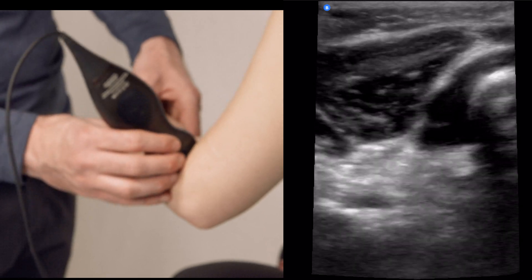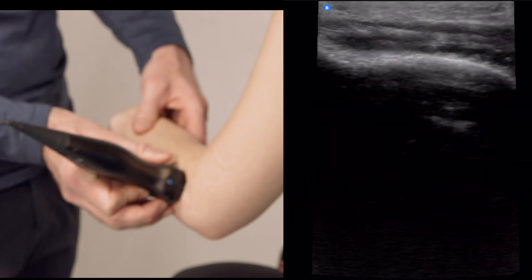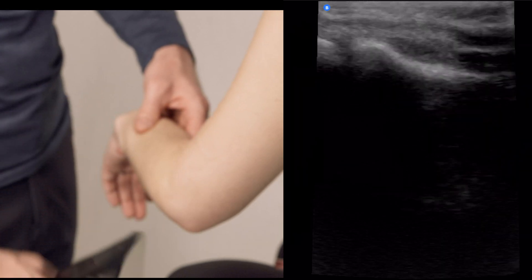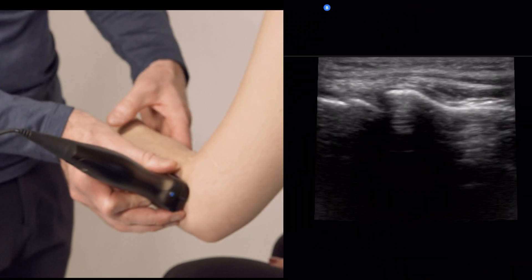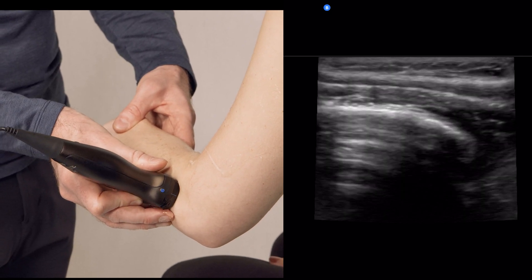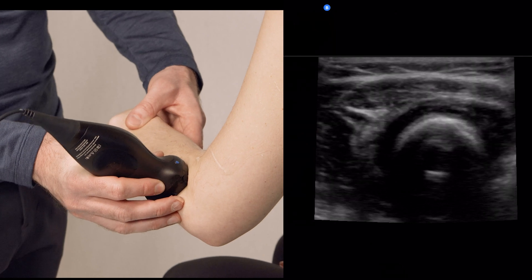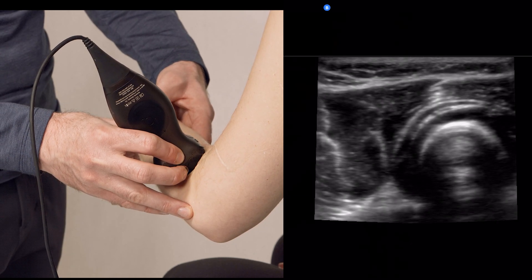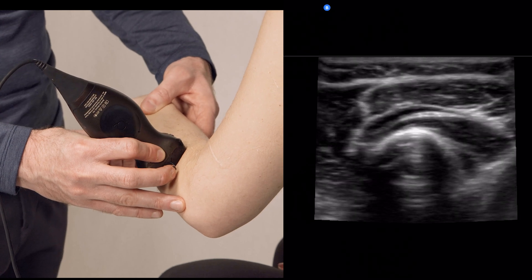What I want to draw your attention to first is the supinator, because the supinator is a very important landmark. The supinator is just above the radius here. Here's the supinator, here's the radial head. The supinator is going to carry the posterior interosseous nerve. Here is the posterior interosseous nerve going through the supinator — you can see those fascicles.